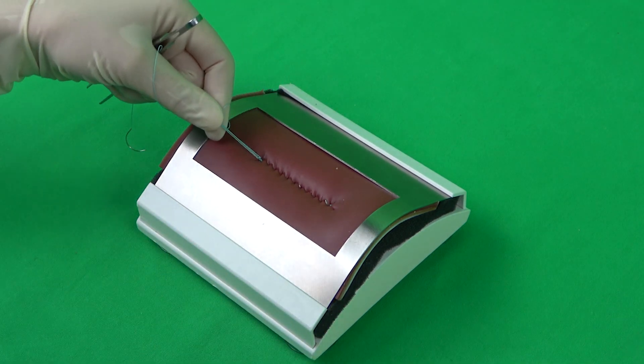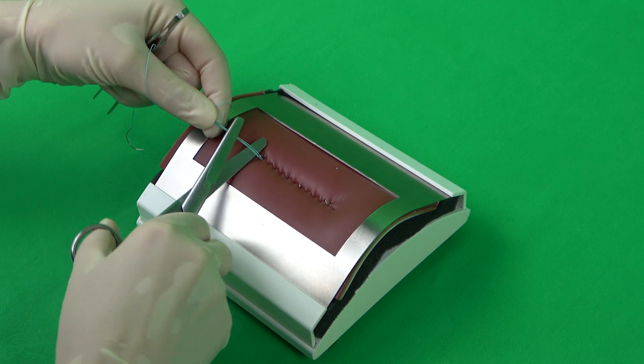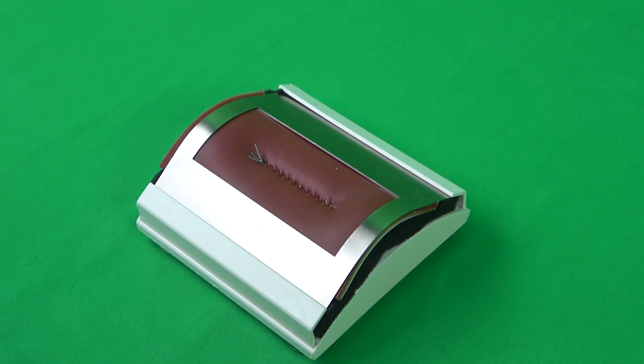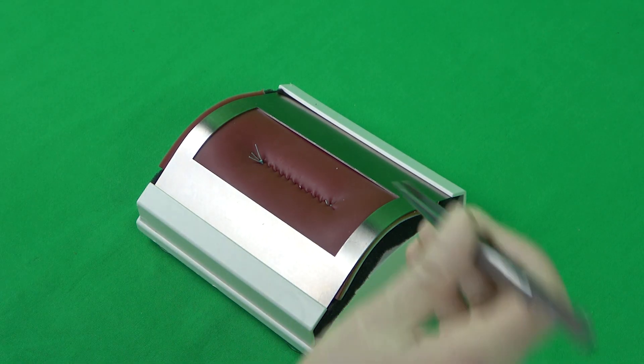The suture thread and loop are shortened to one scissors blade's width. Finally, the suture is inspected for proper closure.